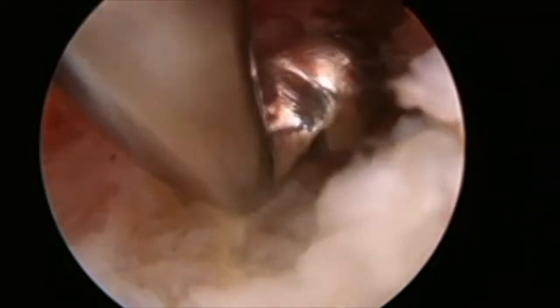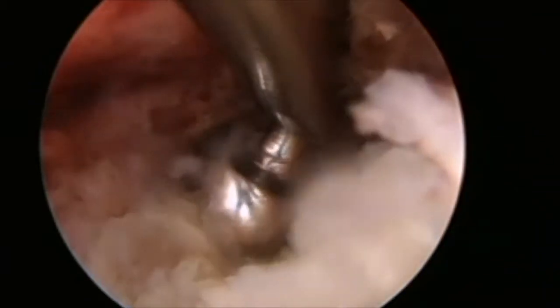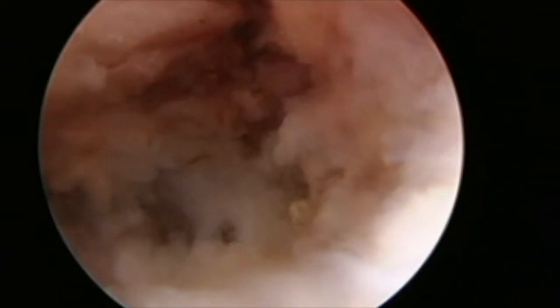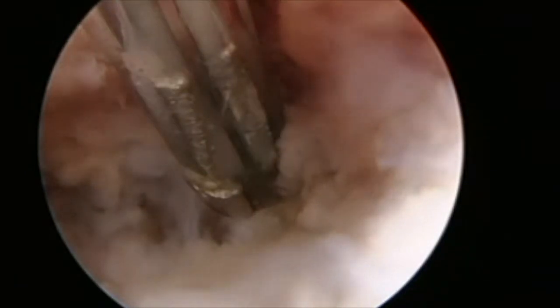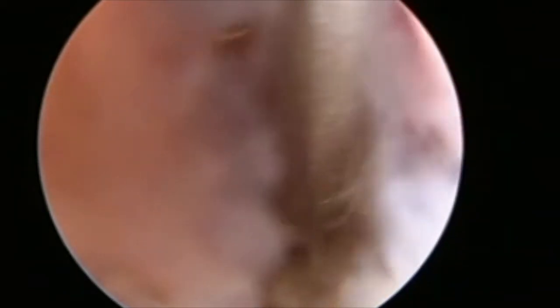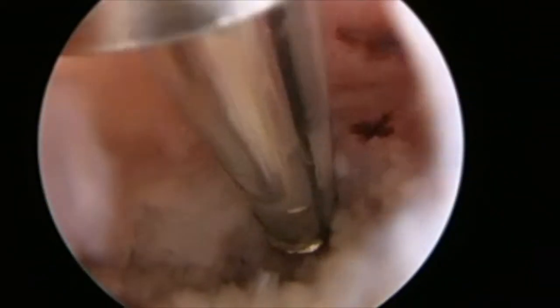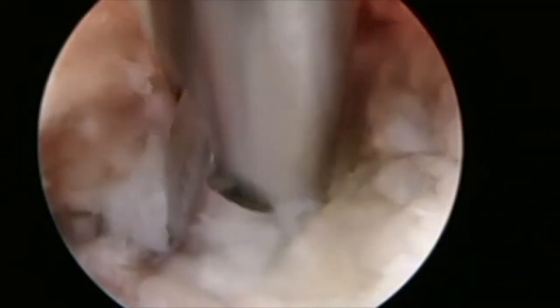At 6 o'clock you can see the annulus, and here I'm just probing the posterior longitudinal ligament to see if there is any disc. Once we identified the disc fragment, the radiofrequency cautery was used to release the disc. On trying to pull the disc, the patient was getting pain, and hence the disc was released further from all sides, and then the fragment was removed in totality.